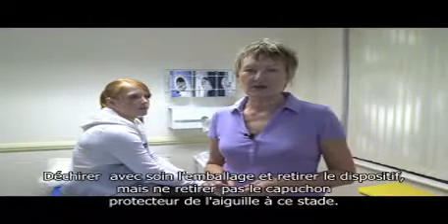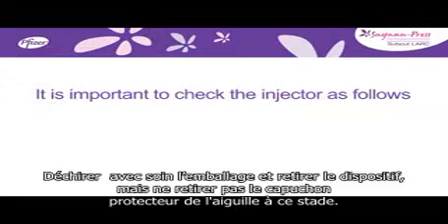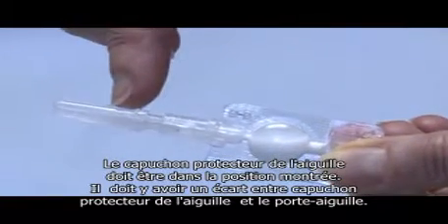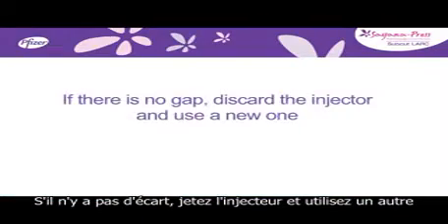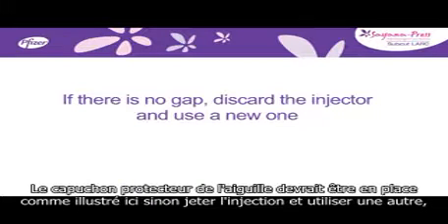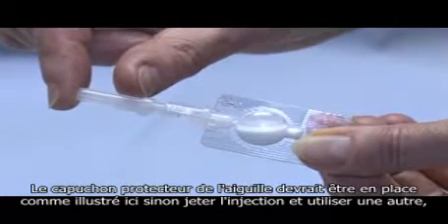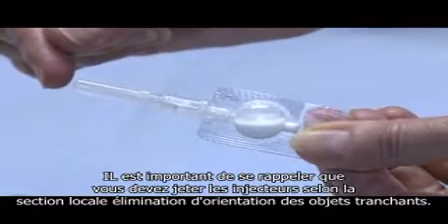When you are ready to give the injection, carefully tear open the foil pouch and remove the injector, but don't remove the needle shield at this stage. It is important to check the injector as follows. The needle shield should be in the position shown and there should be a gap between the end of the needle shield and the port. If there is no gap, discard the injector and use a new one. The needle shield should be in place as shown here. If for any reason it has come off or is missing altogether, you must discard the injector and use a new one.